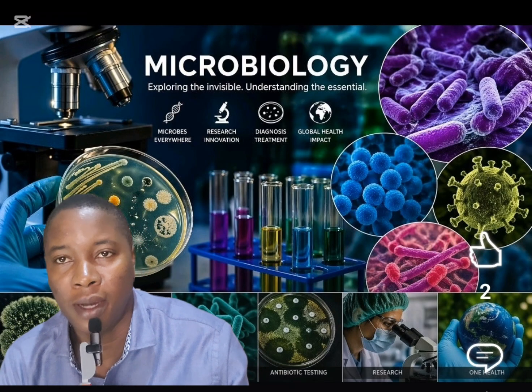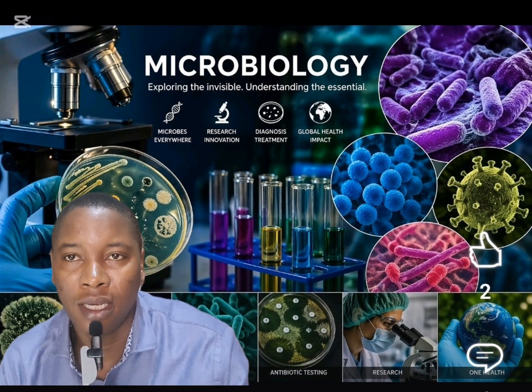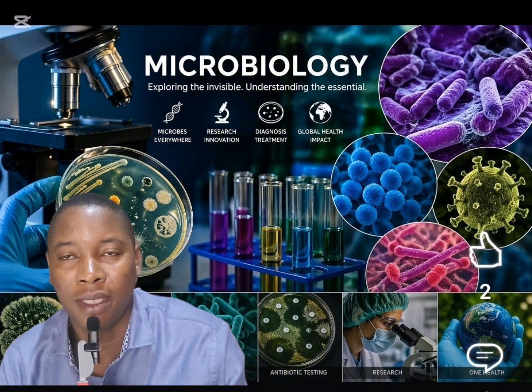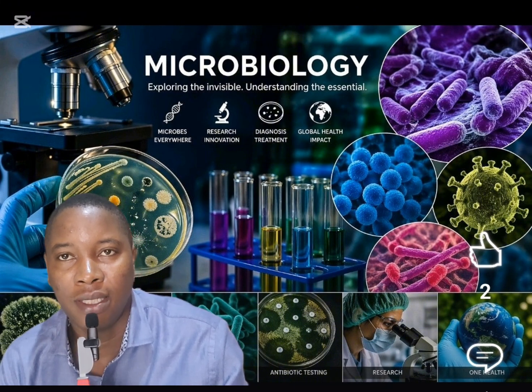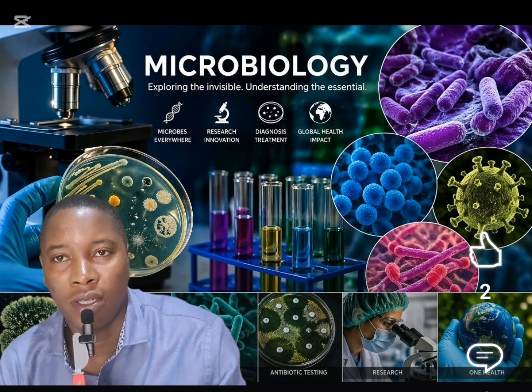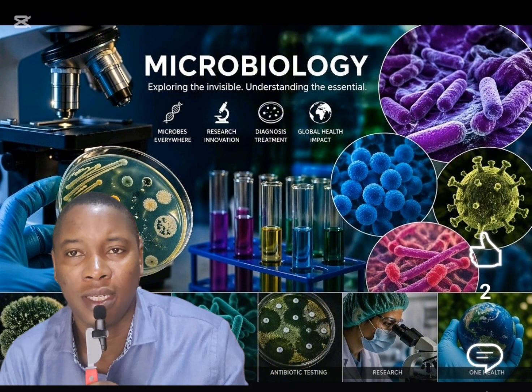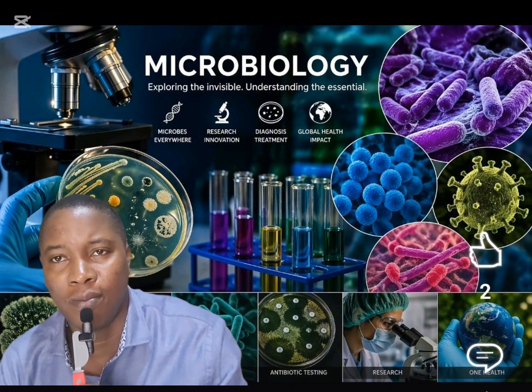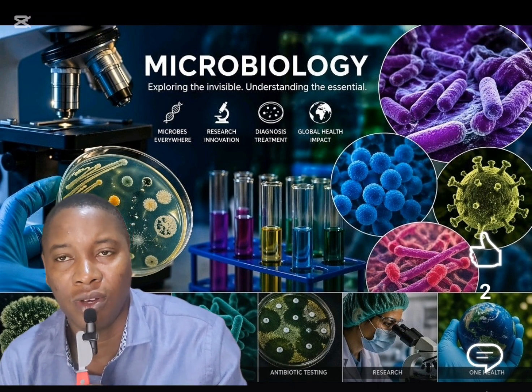Today we just want to talk about antibiotic susceptibility testing. Now, what is this? This is a method used in microbiology to determine the efficacy of different kinds of antibiotics. In times past, when there was not much pressure on antibiotics, people sometimes used to just prescribe and use any kind of antibiotics for any kind of infection. But going forward, it has been important to be able to test out the right kind of antibiotic to use for any kind of pathogen or illness.